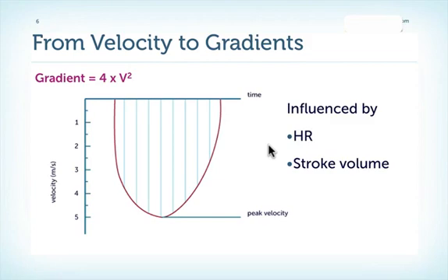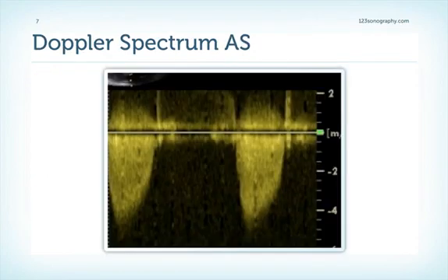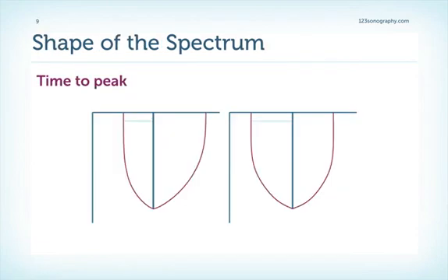If you have low output of the heart, we will find low velocity and also low gradients. This is a typical example of the Doppler spectrum in aortic stenosis, showing a velocity above 4 meters per second indicating severe aortic stenosis. The shape of the spectrum and time to peak also points to severity — a later peak velocity or longer time to peak in systole indicates severe aortic stenosis.